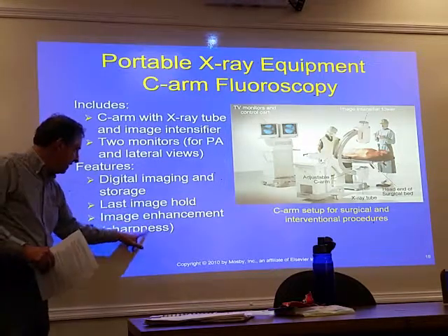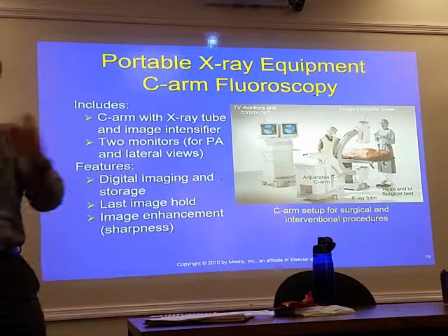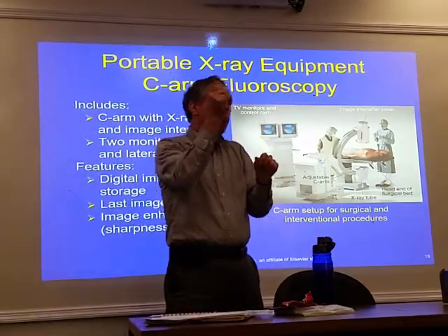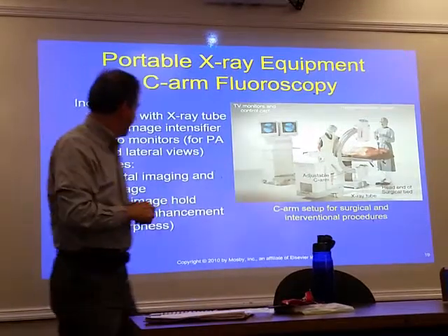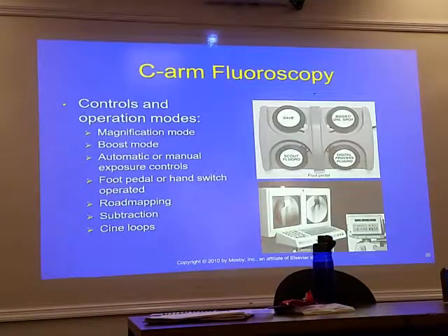Edge enhancement. This is kind of an interesting thing. If you're doing any kind of surgery and they want to see a fracture just along an extremity, you can put that on edge enhancement. It'll look very pixely, but you'll be able to see that fine detail. It really helps, and the doctors really seem to appreciate it.